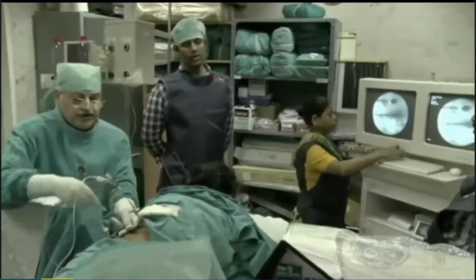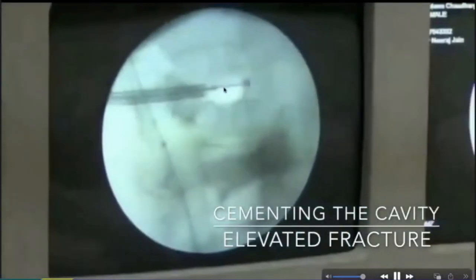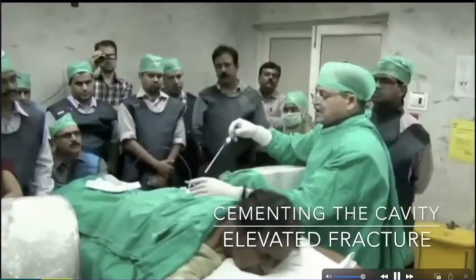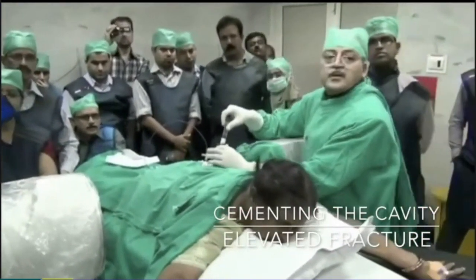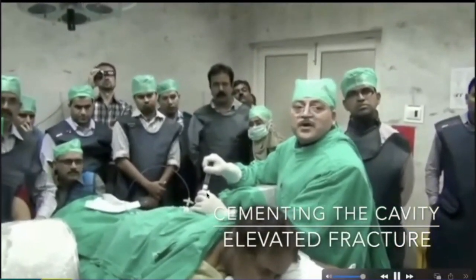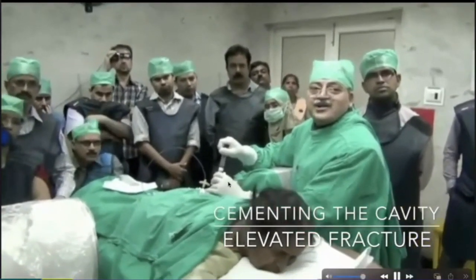And this is the void which you create after the ballooning. Once you remove the balloon, this is already cavitation. You have done a cavitation. Now you simply have to fill the cavity. You take 2, 3, 4, 5 ml, however much you think is the cavity volume. You can go in one go, as in one of the workshops, by the way. In one go, you can inject your cement in there. And you can just see the cement will flow in easily because it is an empty space, so you don't have to worry much. But still, in live fluoro, I'm saying live. In live fluoro, I'm seeing where exactly. It can still leak out.